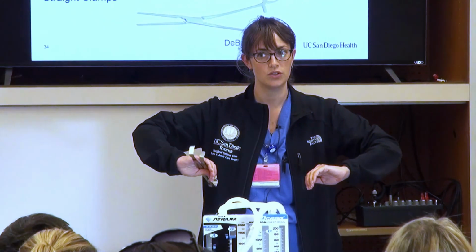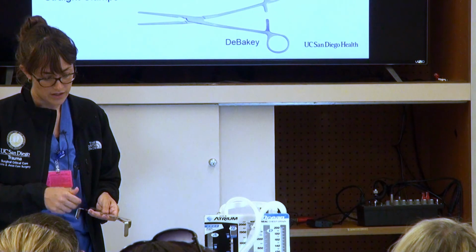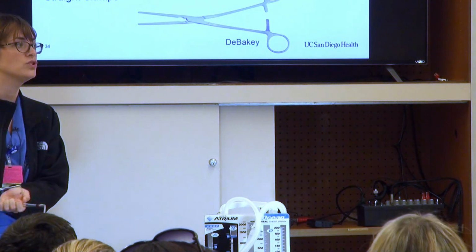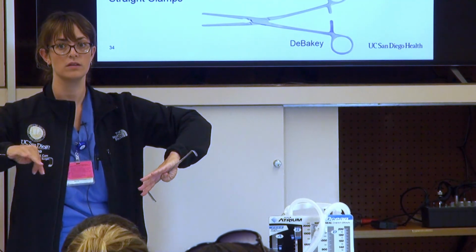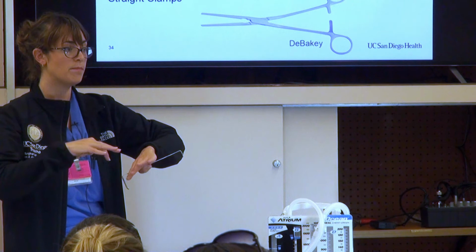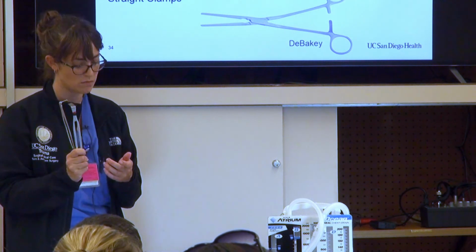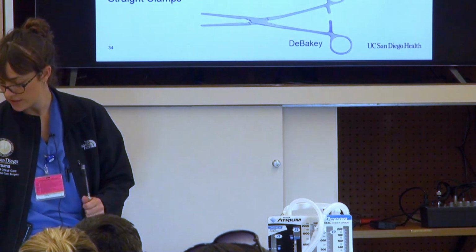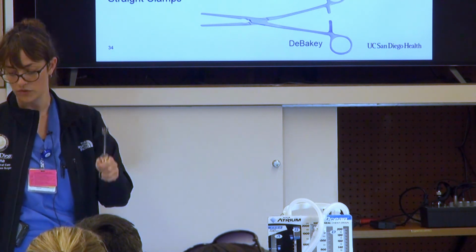People can actually do some manual retraction. It stinks because your hand's really in the way, but if you need to, so be it. The Army Navies can be used to provide some retraction toward the mediastinum, to get the lung out of the way and get better exposure. Maybe there's a cardiac injury and someone needs better exposure. So these can be used as well as the rakes. I showed you these little tiny rakes, right? There are big rakes as well, and they may be useful.